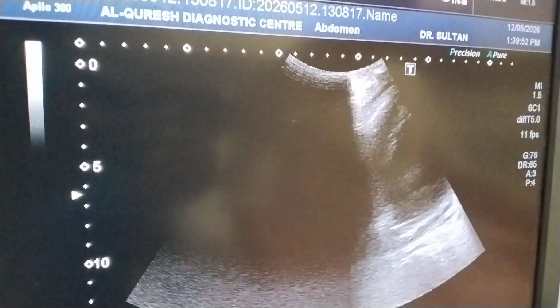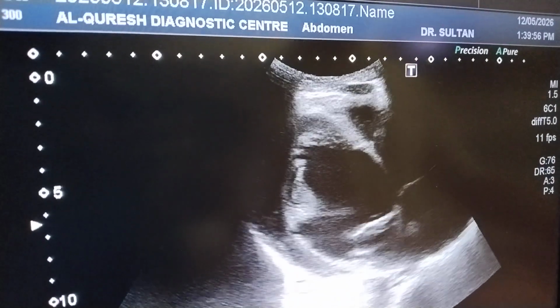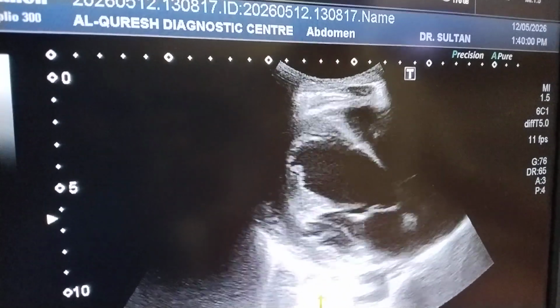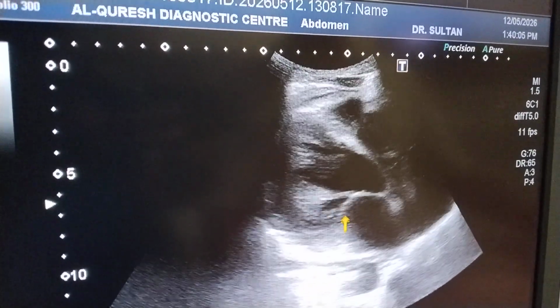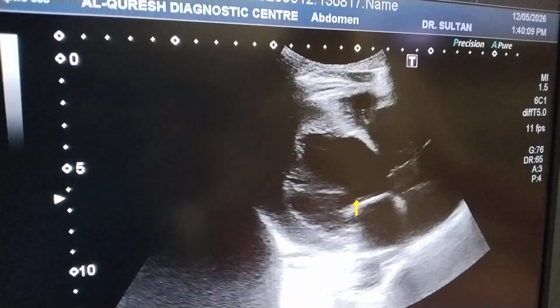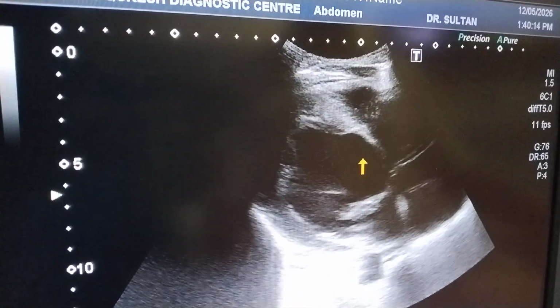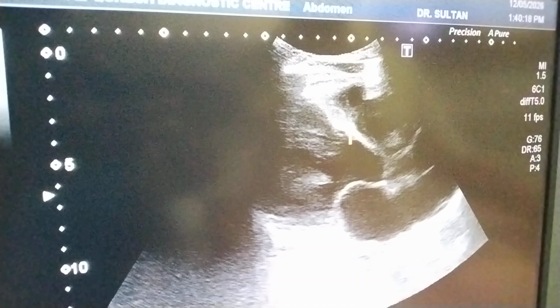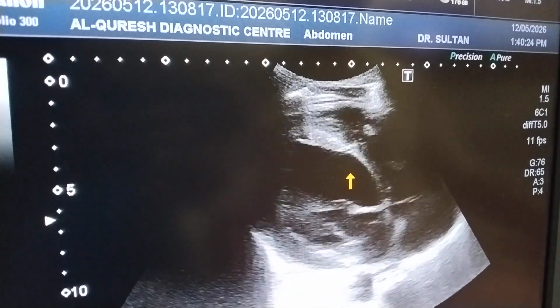We are not going to do the echocardiography, as I am not good in this. However, we can appreciate this one. This is the mitral valve, a posterior leaflet and anterior leaflet, and this anterior leaflet must be very close to the interventricular septum in the usual practice of the normal heart.